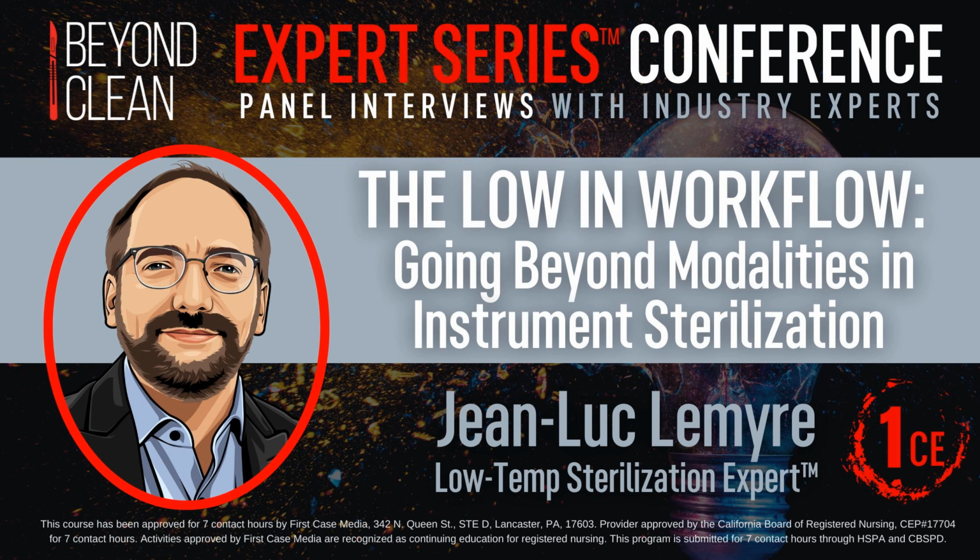Yeah, a larger chamber definitely would help some larger facilities, but I'm sure a lot of smaller facilities probably don't have a need for a much larger chamber, while having two or three smaller sterilizers may give them more flexibility in their workflow. Yeah.